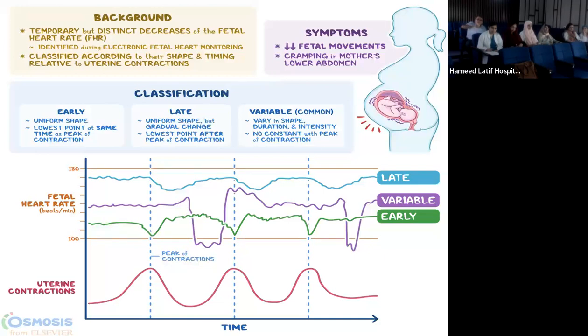If this continues, okay, if you put on syntocinon and forget about it, or more commonly if you're not properly monitoring it, if you have stepped up syntocinon, then it slowly starts affecting the baby. Initially it will have a buffer, a mechanism to auto-correct itself. But if you repeatedly cause this to happen, and if the baby is chronically already hypoxic, if the baby is IUGR, then you will have more chance. So the partial pressure of oxygen is reduced.